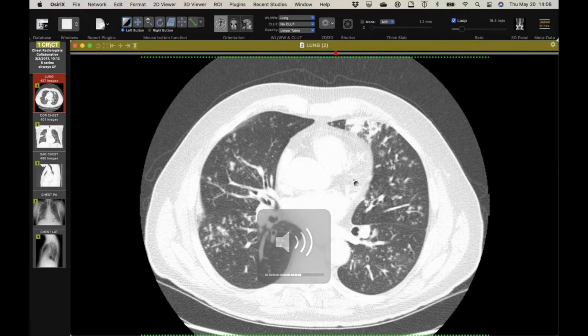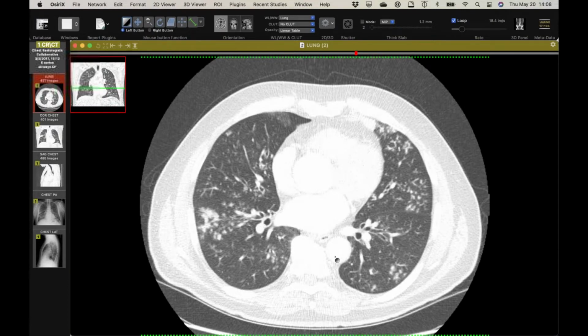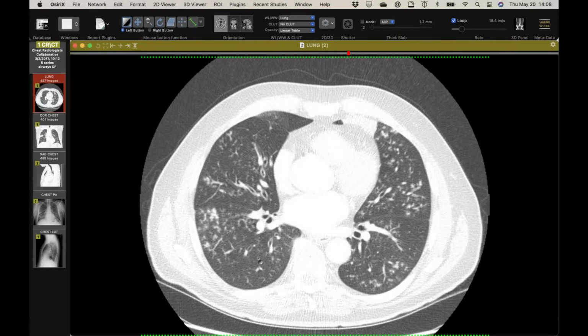Well, we have a big cystic fibrosis adult clinic, and this looks like the ordinary pseudomonas or staphylococcal colonization that these people get. He's got some rarefaction posteriorly on the right there that makes me think he probably has some air trapping. So there's some small airways dysfunction, not just clogging with secretion. Some of that could be reversible if the infection and the swelling go down. But it sure looks like the ordinary bacterial colonizations, usually Pseudomonas, those are the common bugs.